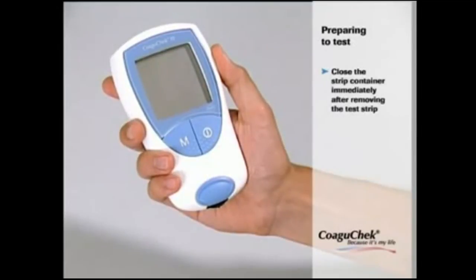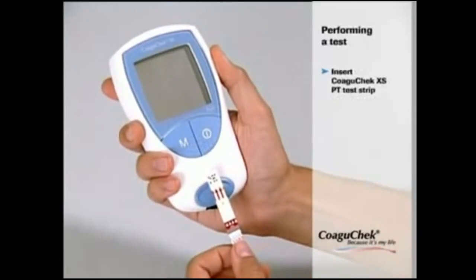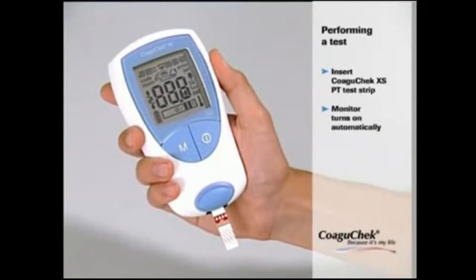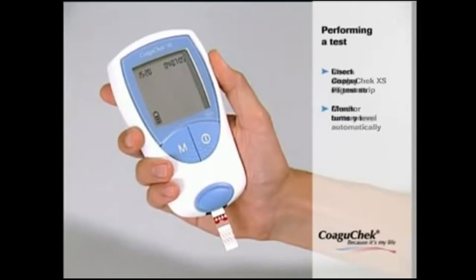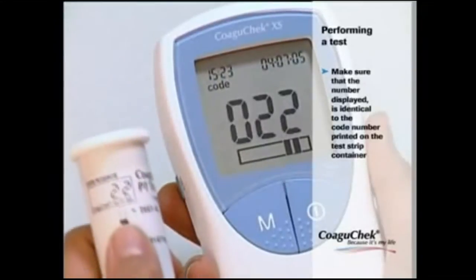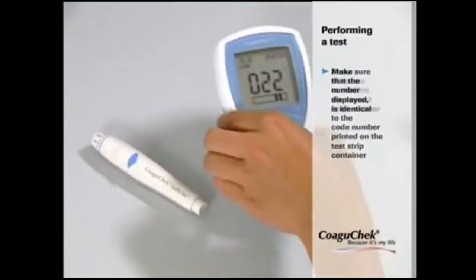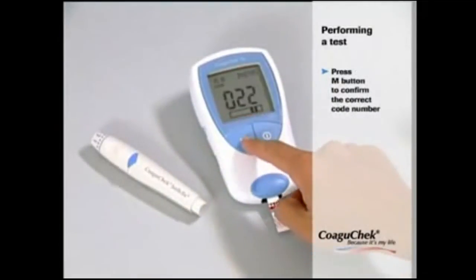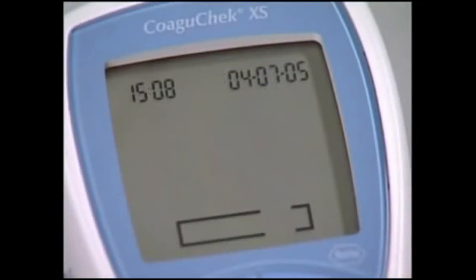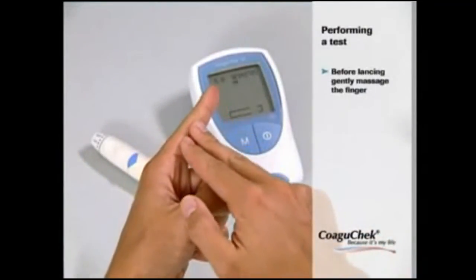Please close the strip container immediately after taking out a test strip — leaving the container open may damage the strip and cause error messages. Insert a test strip with the labelling facing upwards; the monitor turns on automatically. Check that all display segments are shown properly and check the battery level. The code number of the inserted code chip is displayed — make sure it matches the code number on the test strip container. Press the M button to confirm the numbers are identical. The code number stops flashing and the test strip begins warming up — this is the perfect time to start getting your blood sample.